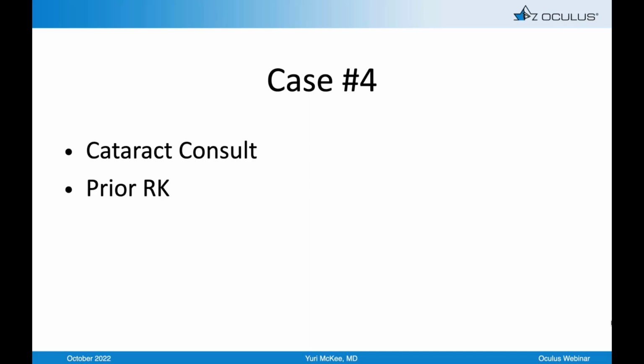And the best mathematicians in the world, for example, the guy I share an office with, Warren Hill, can solidly hit in the mid 70 percentile on predicting the correct IOL power after refractive surgery. So if you're as good as Warren Hill, you can offer someone a 70% chance of getting the right lens power after refractive surgery. And if you're not, you're lower than that. And I tell people that.